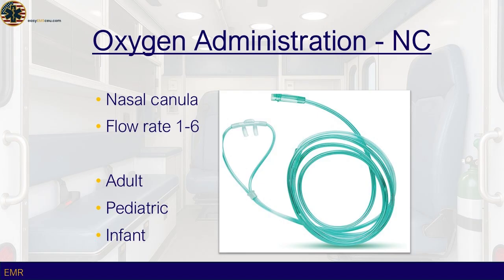The standard flow rate ranges from 1 to 6 liters per minute, LPM, delivering approximately 24% to 44% oxygen concentration depending on the patient's tidal volume and respiratory effort. Because nasal cannulas allow patients to talk and eat while receiving oxygen, they are often a preferred option in non-critical cases or when patient comfort is a priority.